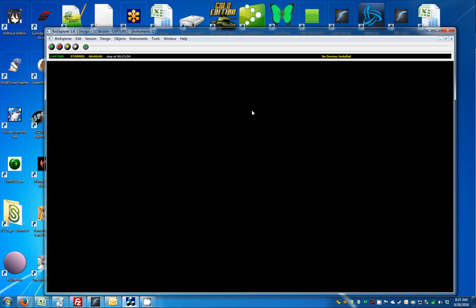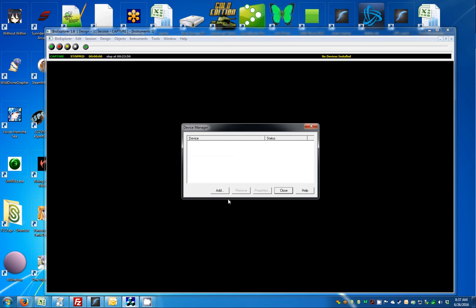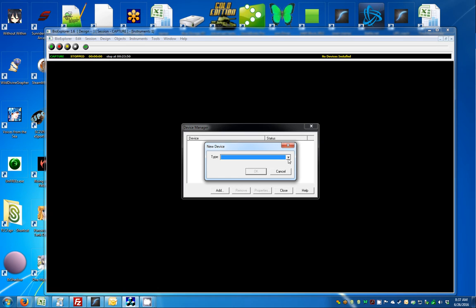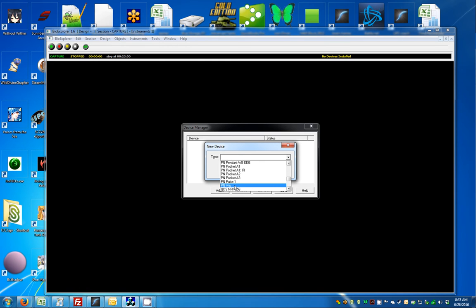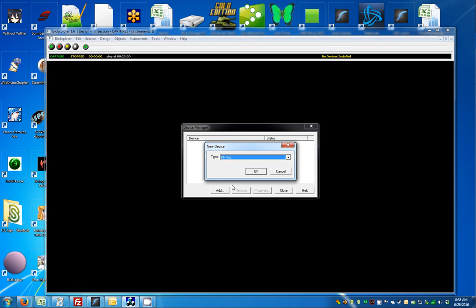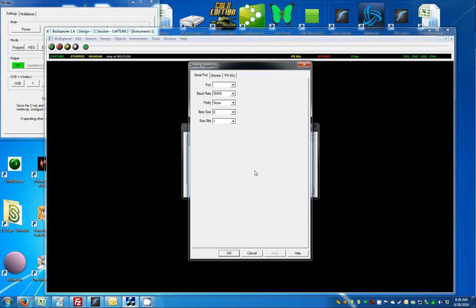To add a device in BioExplorer, in the menu select BioExplorer, then Devices, then Add. In the drop-down, scroll through until you find your device. When you see your device, select it and select OK.